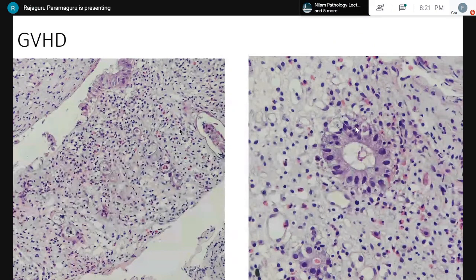That is, the microabscesses will be plenty, and it will look like an abscess with a cavity and a lot of these apoptotic fragments. Not so classical here, but you can still see that it is a kind of vacuole with a lot of nuclear debris inside. So whenever this is exaggerated, it is called an apoptotic microabscess.